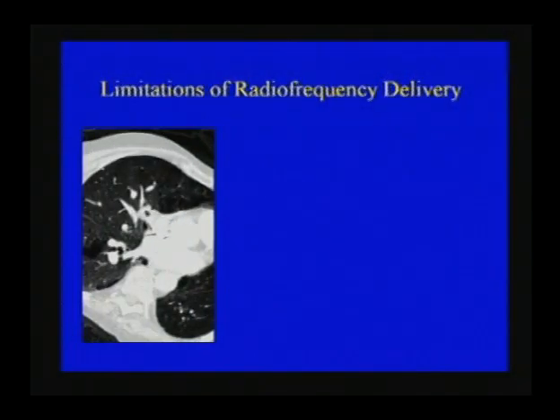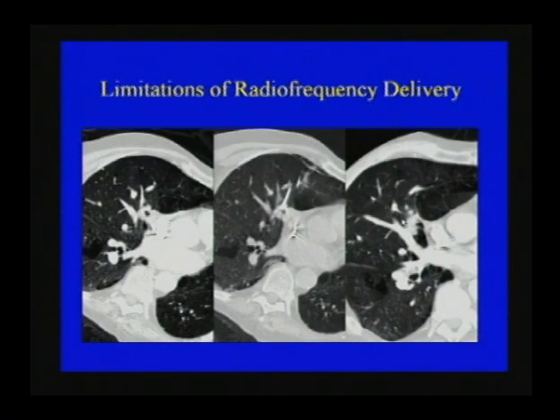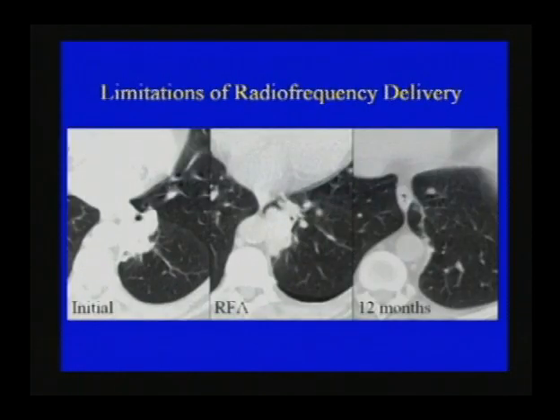So here you see a case that we took on. Here's the lesion. And the nice thing about working with a very aggressive colleague is that we had to prove that these things were difficult, and we placed the needle into the lesion. And what you see is that, in fact, after we've tried to do a burn, there is no halo to be seen. The lesion looks not very different, and no real damage, thankfully, done to the adjacent structure. This is a heat sink effect.